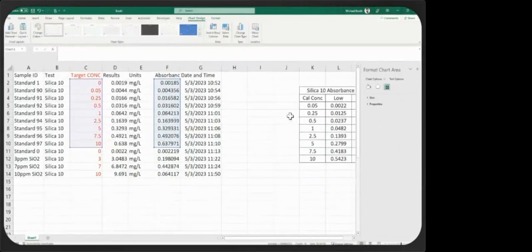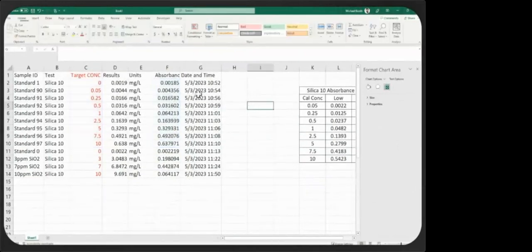Next up, we're going to check to see if our absorbances are in range. So I'm just going to take our absorbance data from the first standard. We don't really include the blank on these checks. There's a little bit more variance, and as Liv has shown, she does a good job of checking the backgrounds on the instrument.